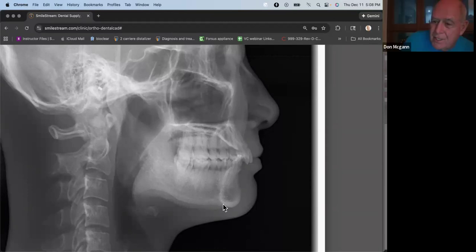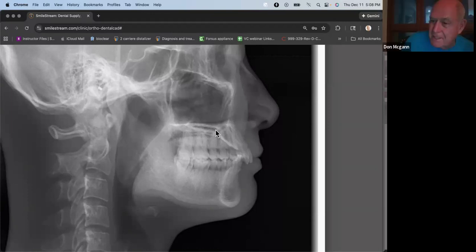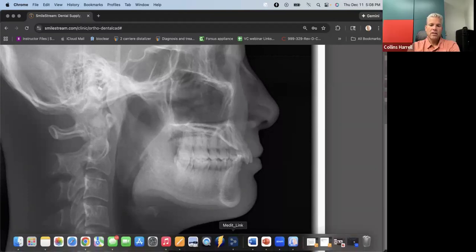So in your control is straightening the teeth and then correcting the class 2. Well, that's the patient doing that. And I'm questioning, even if he went distalization and class 2 elastics and everything else, I think you're going to have to accept a little class 2 and overjet. You're going to improve it, but you're not going to correct it all the way. Exactly. The nice thing is that you can do IPR at the end.